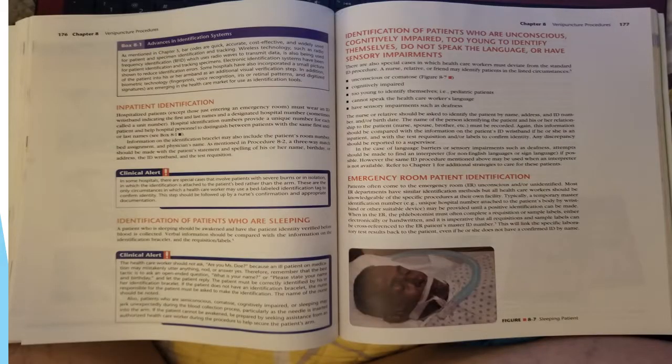Box 8.1, Advances in Identification Systems. As mentioned in Chapter 5, barcodes are quick, accurate, cost-effective, and widely used for patient and specimen identification and tracking. Wireless technology such as radio frequency identification, which uses radio waves to transmit data, is also being used for patient identification and tracking specimens. Electronic identification systems have been shown to reduce identification errors.